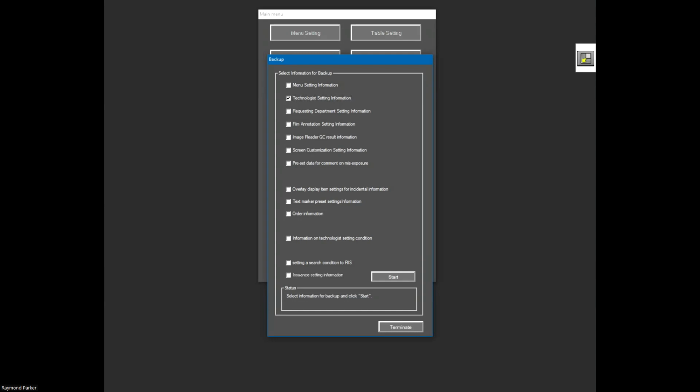You don't have the menus because you don't want to cross menu platforms. So you don't want to put your FDR Go Plus menus on any other unit, or vice versa. You wouldn't want to put a Devo Suite menu set onto your portable. I can guarantee you that it will not work properly.